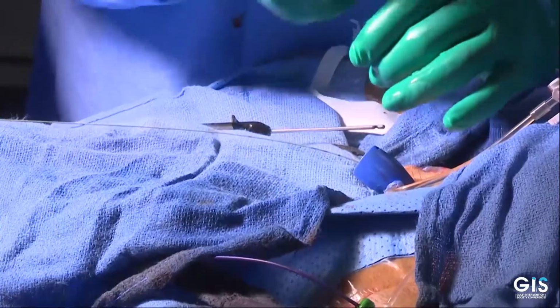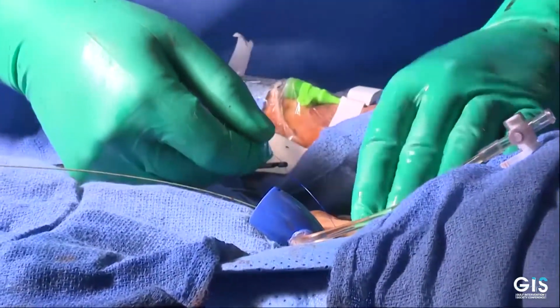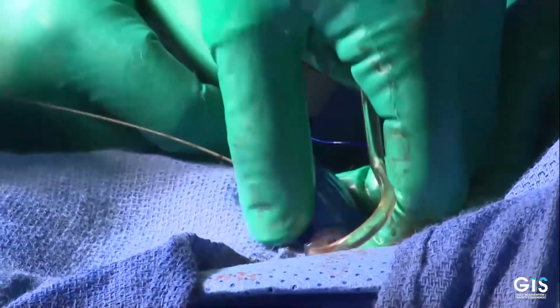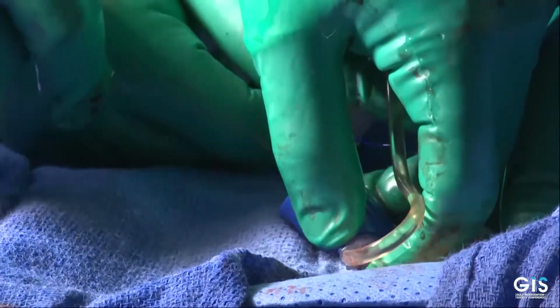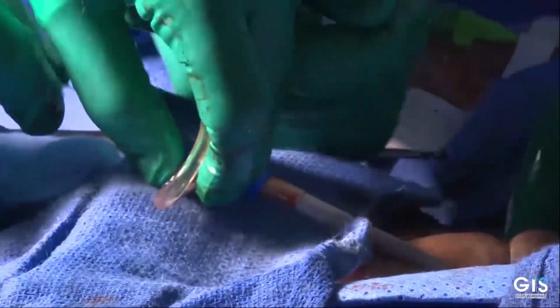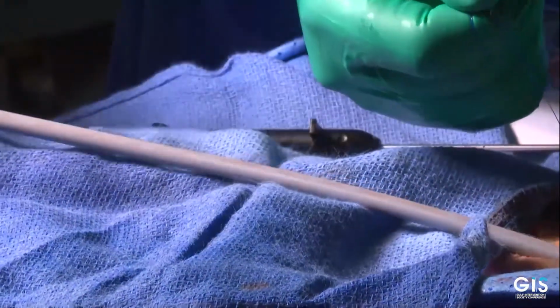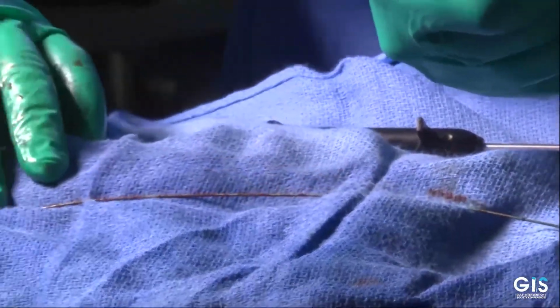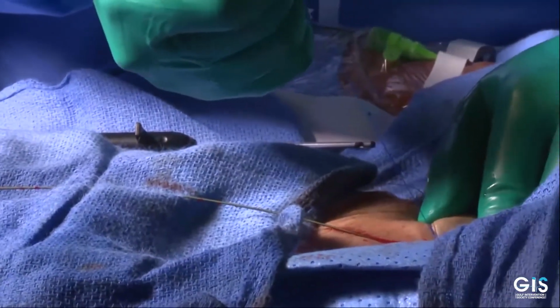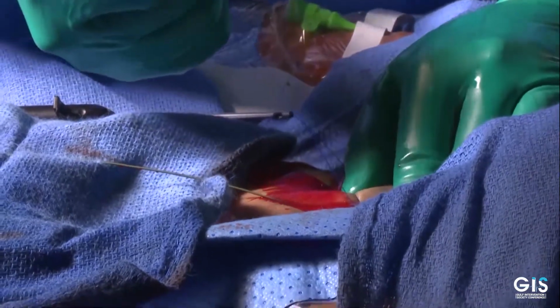So what I'm doing is wrapping the thread around my index finger on the right hand, and I will be controlling the bleeding. Dr. Fahad will go ahead and remove that, and we'll maintain just the regular J wire in place. Okay, keep going, keep going. As he's coming out, I'm applying tension on the wire, and as you can see, I deployed my knots and slid them all the way to the top of the artery. I'm maintaining tension, and then I check for bleeding.